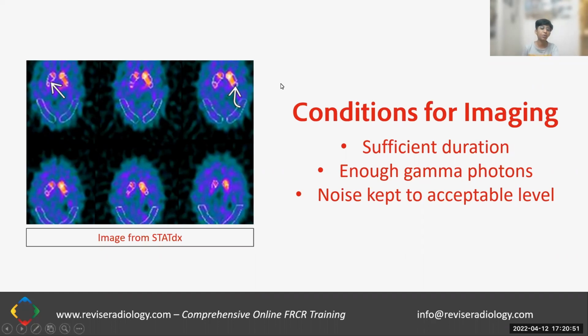Yeah, so the way that you can think about this is just picture a person singing a song during a thunderstorm, and somebody's trying to record a person who's singing a song during a thunderstorm. So if the person is singing the song extremely softly, when you listen to the recording, what you'll hear is mostly the sound of the rain and the thunder and not so much the sound of the singing. Whereas if the person is singing loudly enough, when you listen to the recording, you'll hear the song very clearly.